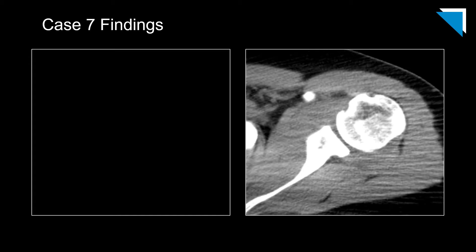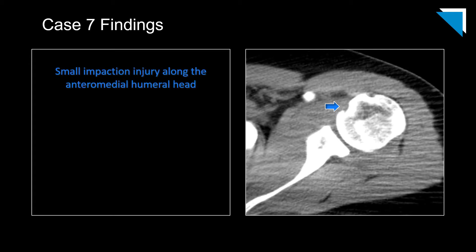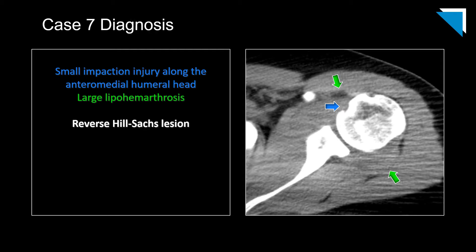Perhaps you appreciated the small impaction injury along the anterior medial aspect of the humeral head. If you're not familiar with the normal anatomy of the proximal humerus, you might mistake this for the bicipital groove. As mentioned when scrolling through the images, there is also a large lipohemarthrosis. Had you missed the impaction injury on the bone windows, this would have alerted you to the underlying pathology.